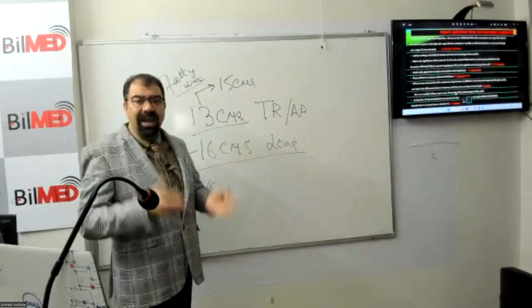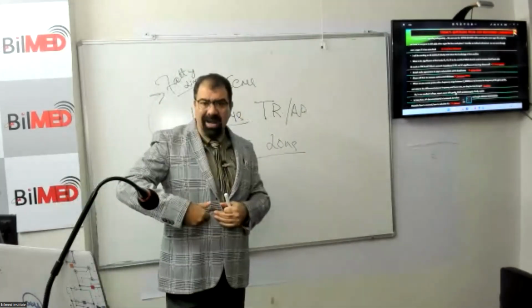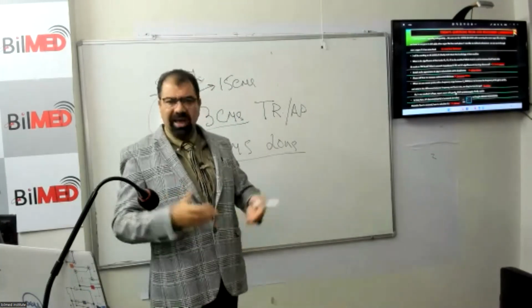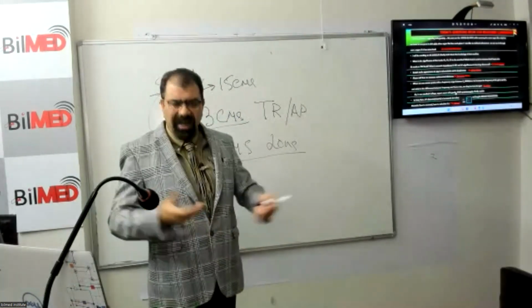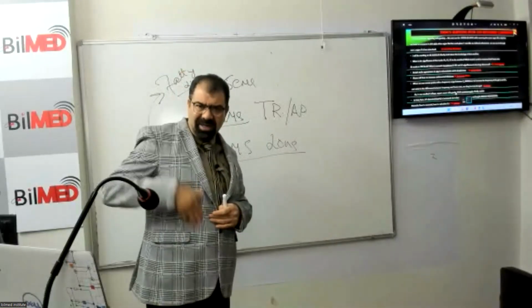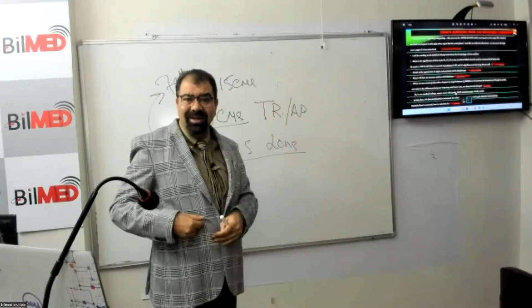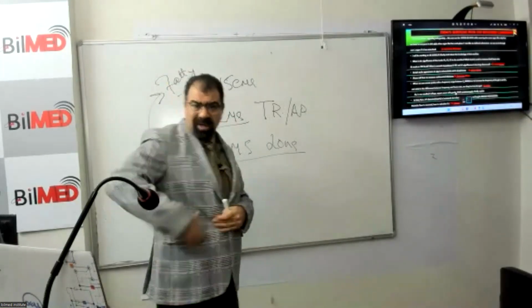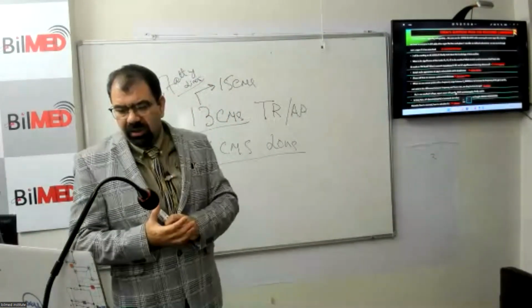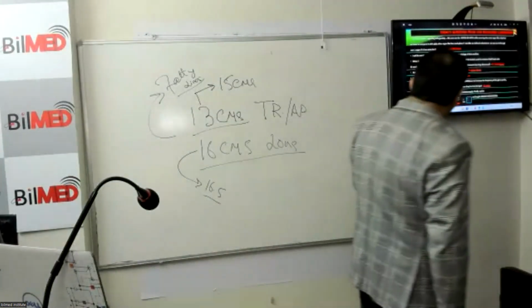That is why when you report a fatty liver with increased size, your consultant doctor will palpate, and he is not able to palpate. Then he may think that this report is wrong. But actually, the increase is not in length. Had this been in length, then only it could have been palpated by that consultant. So the more increase is in AP. This was the answer for this question.